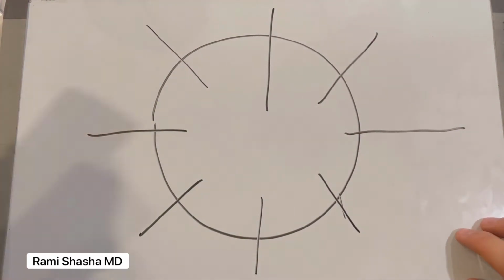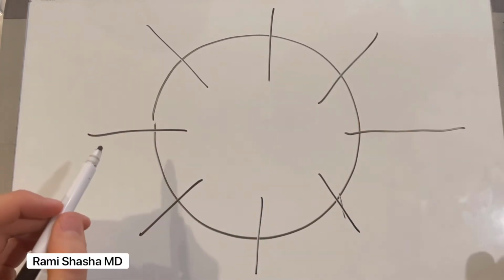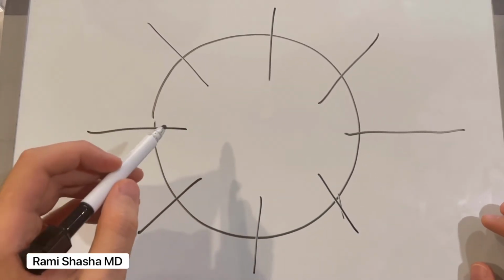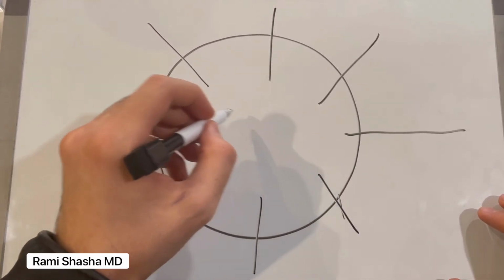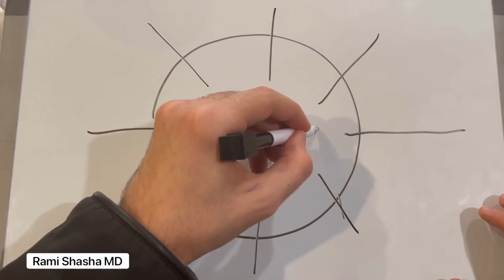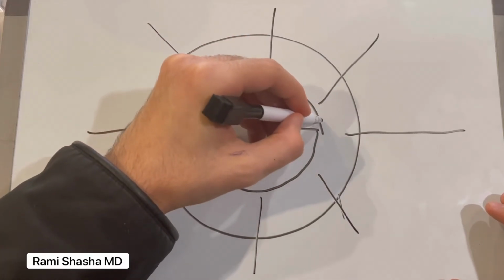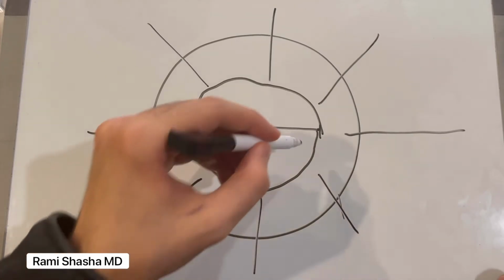Well, let's just make it a little bit easier for this specific case. Well, you're at the mercy of where they attach. You have to make the capsulorhexis where the edge of the capsulorhexis does not meet the edge of the long anterior zonule. So in this case, if I'm going to make the capsulorhexis, I'll start here and make my way around and delineating to ensure that I'm not within that region here.